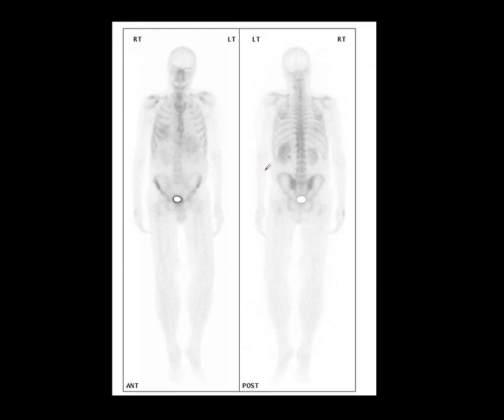Those cells aren't able to maintain a normal calcium pump, so they can't expunge calcium outside of them, and they accumulate intracellular calcium. Calcium gets deposited inside the cells, and then the methylene diphosphonate tracer becomes adsorbed onto these internal cellular structures, just like barnacles become attached onto a pirate ship that sunk many years ago.